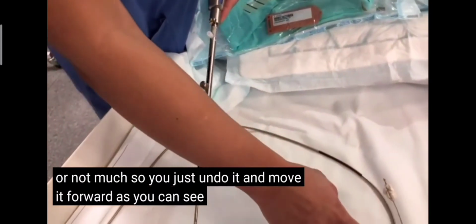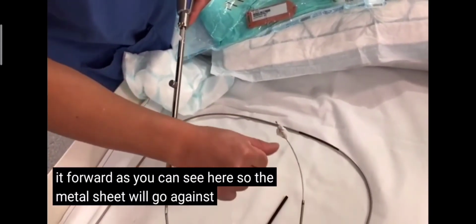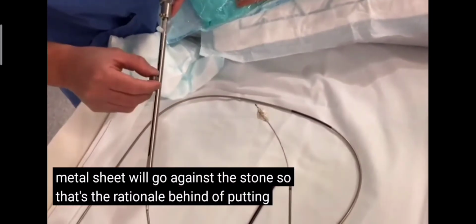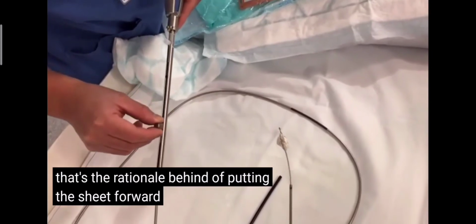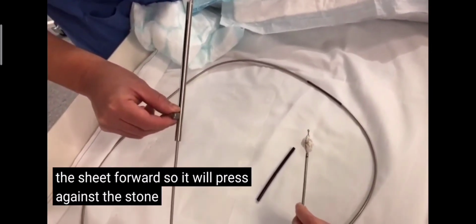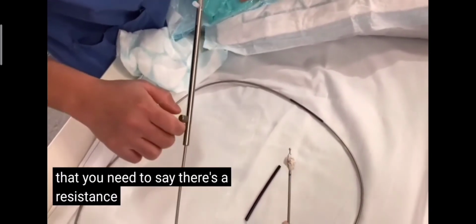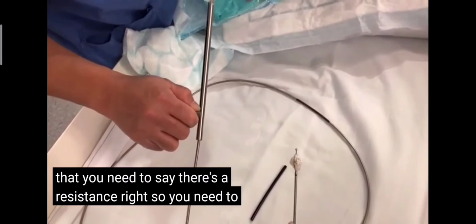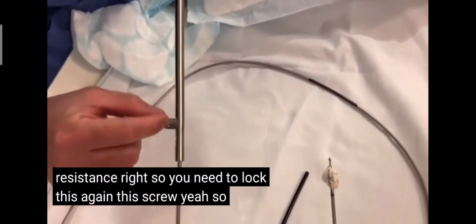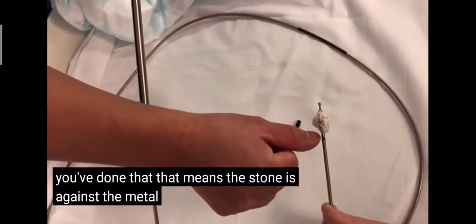As you can see here, the metal sheet will go against the stone. That's the rationale behind putting the sheet forward. It will press against the stone. When you've done that, you'll feel a resistance, right? So you need to lock this again. This is the screw. When you've done that, that means the stone is against the metal, right?